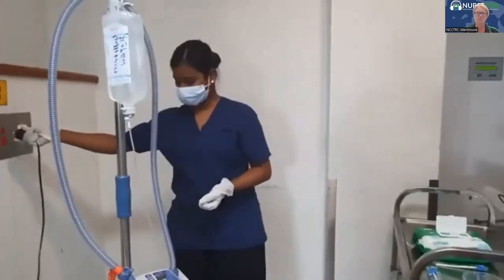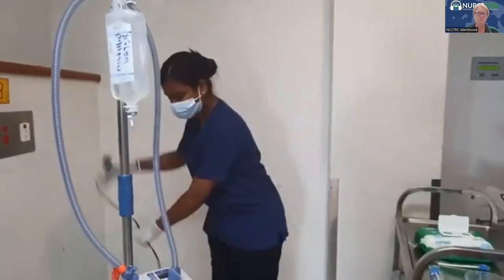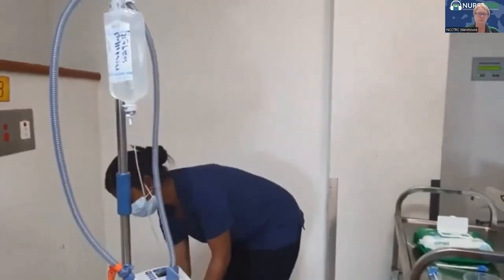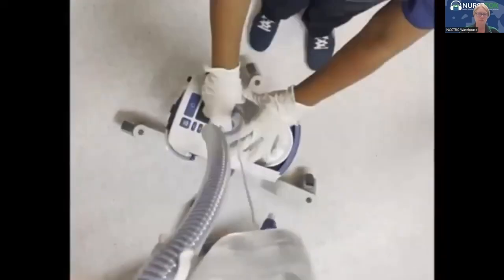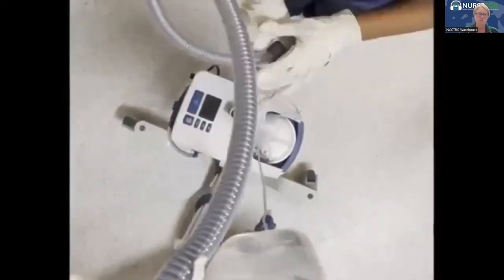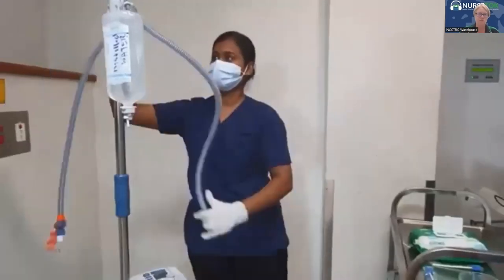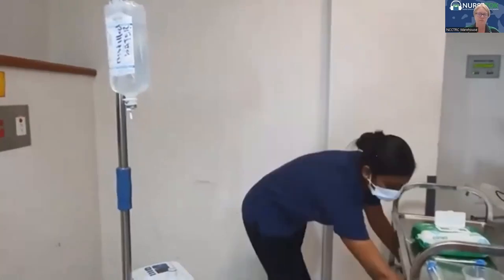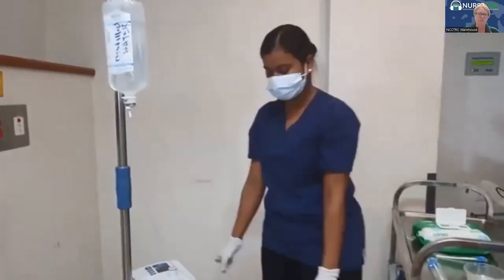Then we remove the heated breathing tube. Discard. Remove the water chamber and sterile water bag from the machine.